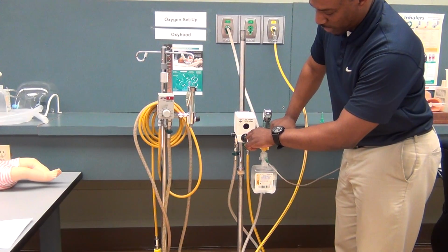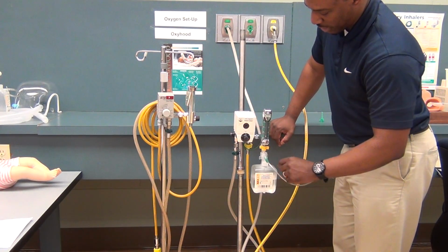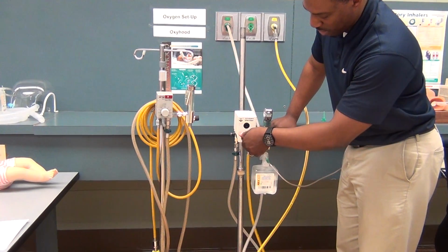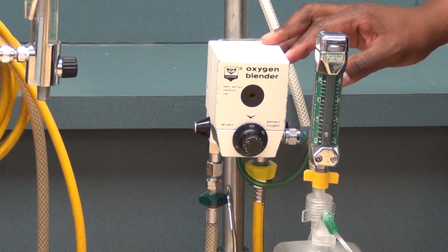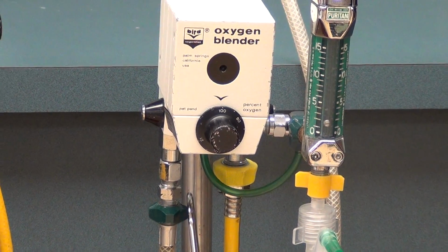Currently, our patient is receiving 40% oxygen because that is what we have our dial turned to. If we want 21%, we turn it there. Or if we want to go to 100%, then we can go there. So the blender just allows us to give an exact FiO2 to our patients. That's it.